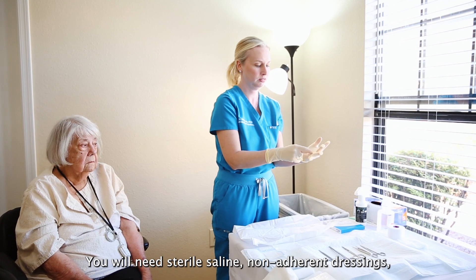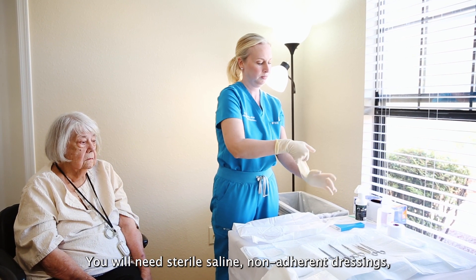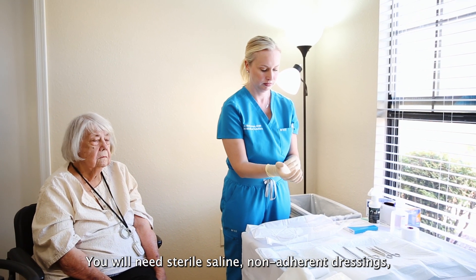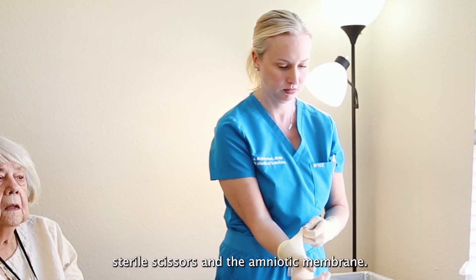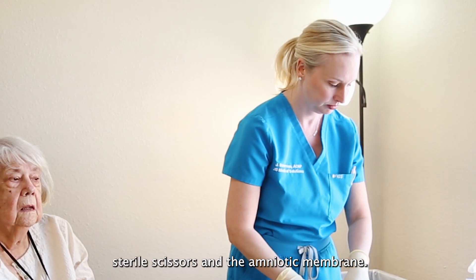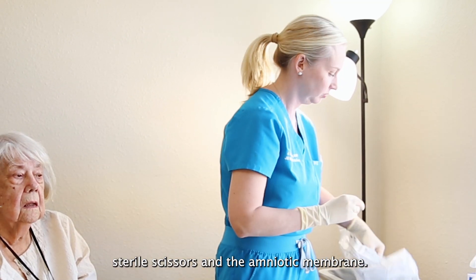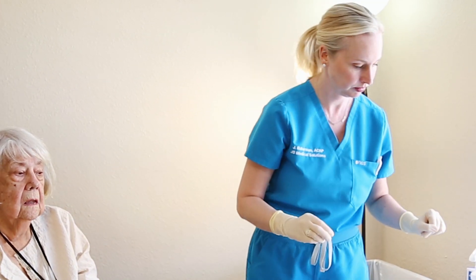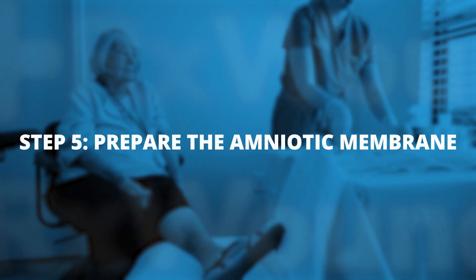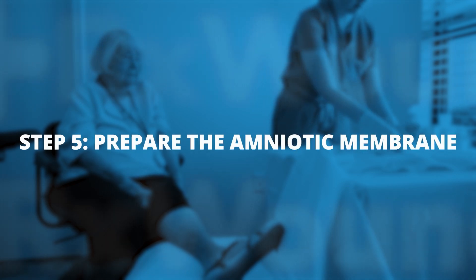You will need sterile saline, non-adherent dressings, sterile scissors, and the amniotic membrane. Step 5: Prepare the amniotic membrane.